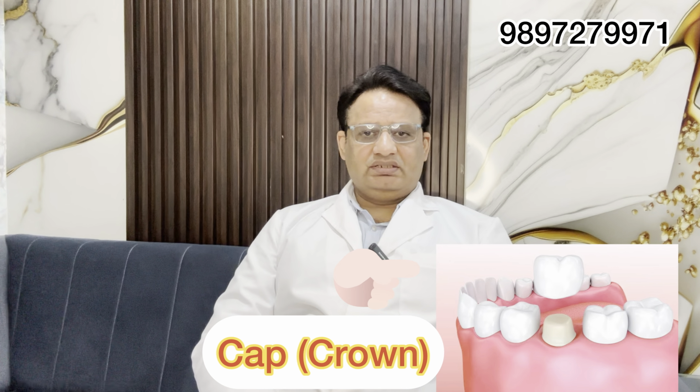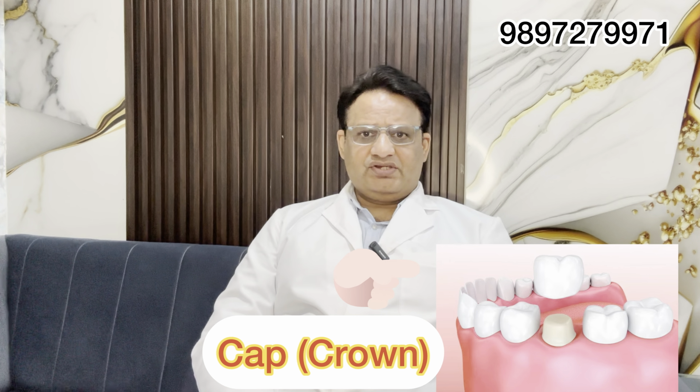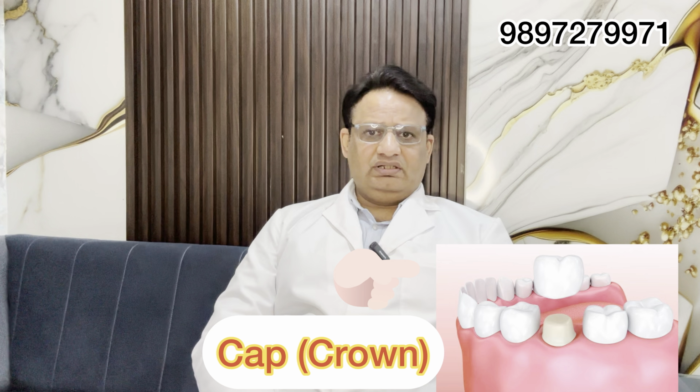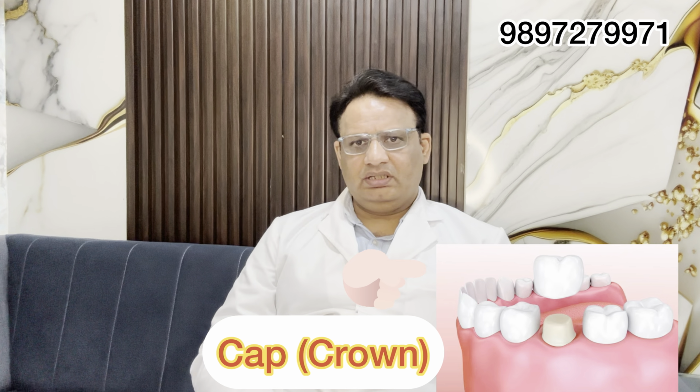The obturation is also a last step, but after the RCT, the final step is capping. Capping is the most important step in RCT because if you do not go for the capping in the RCT treated tooth, then the tooth will get fractured in a few months because the masticatory forces will break the tooth. So if you want to avoid the extraction of the tooth after RCT, then definitely we have to go for the capping, because capping bears all the load of the masticatory forces. If the patient has the cap on the RCT treated tooth, then all the masticatory load comes on the cap and the tooth remains safe.